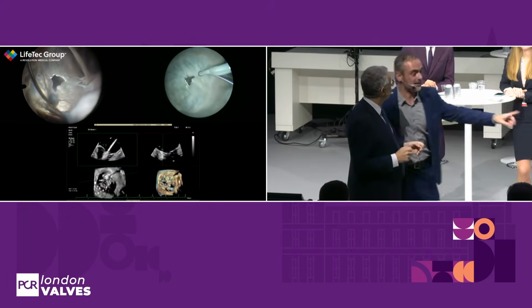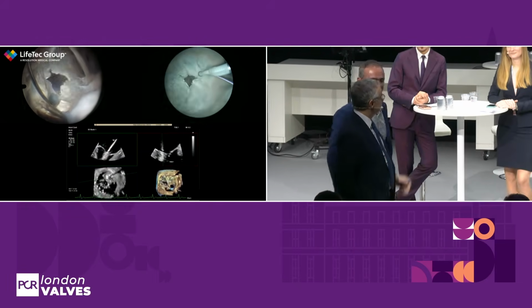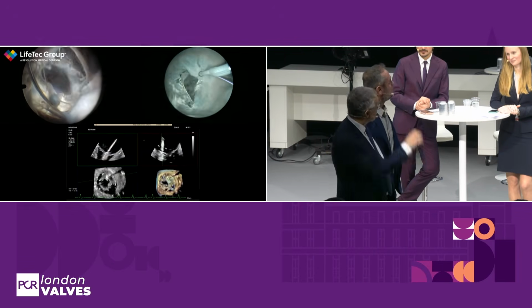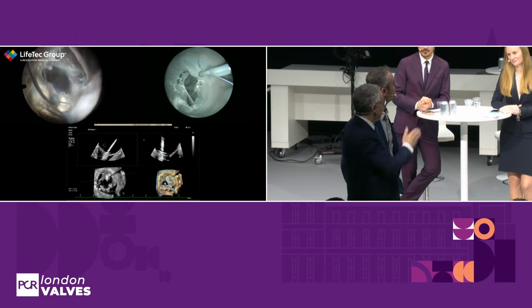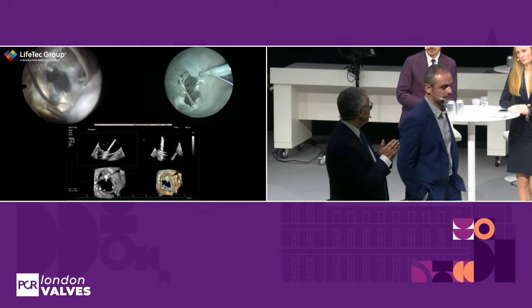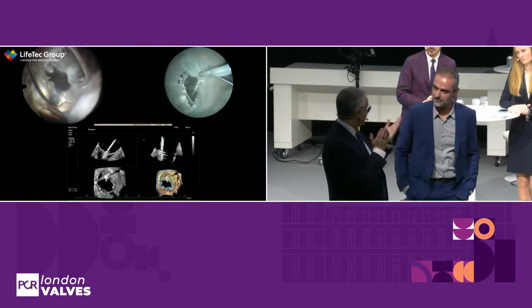What do you think about that? I love it. But it's not always possible, no? No. I mean, it is not always possible. Obviously, you show how you can jail, and actually you are abolishing that portion of the leaflet of the valve, which is a great situation.